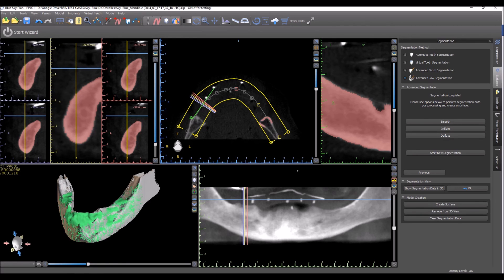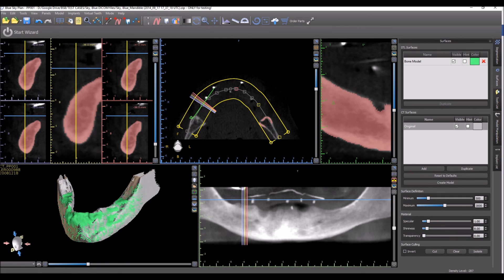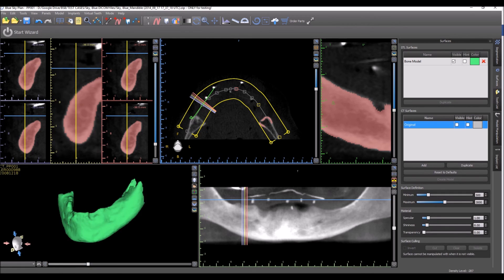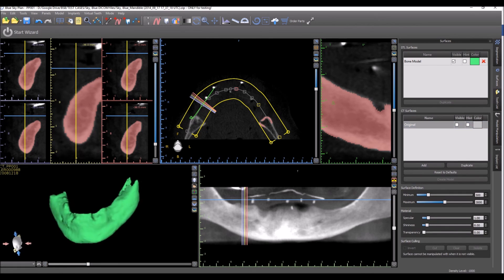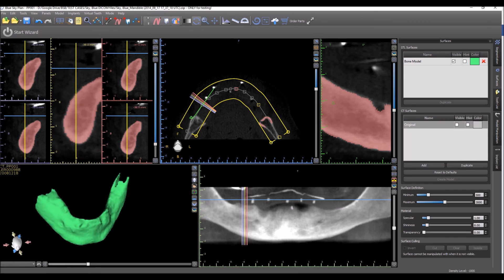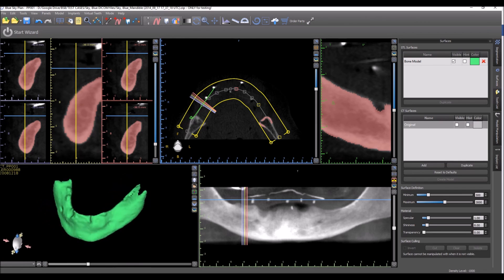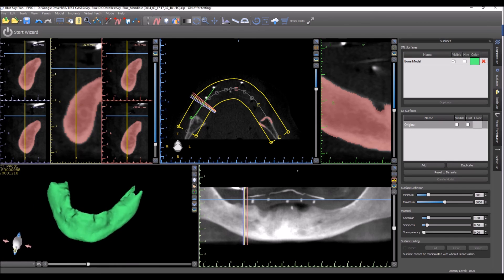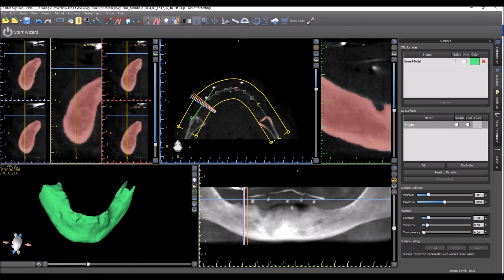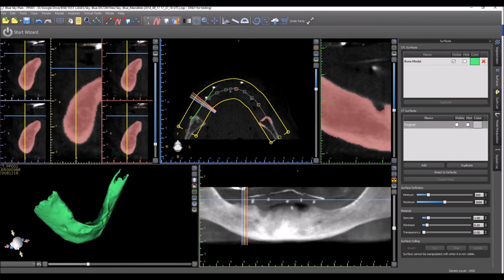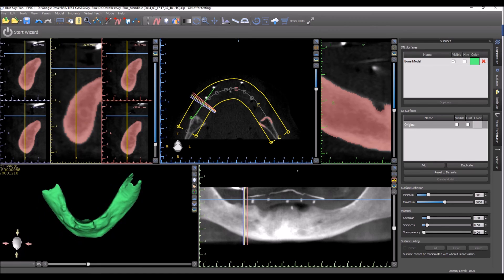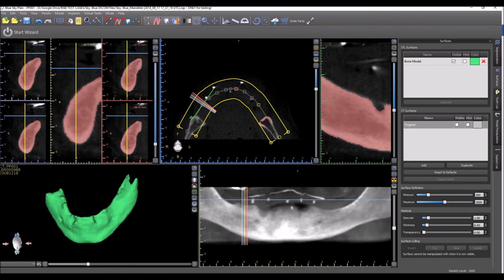We can press create surface. When we go to the surfaces list we can see our mandible has been turned into an STL surface. This can now be used to create a surgical guide.